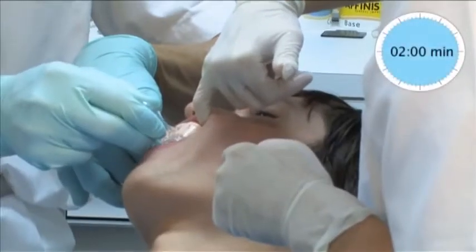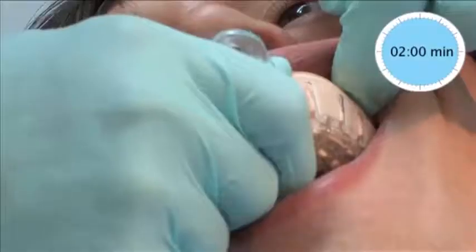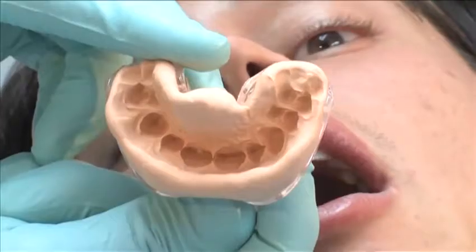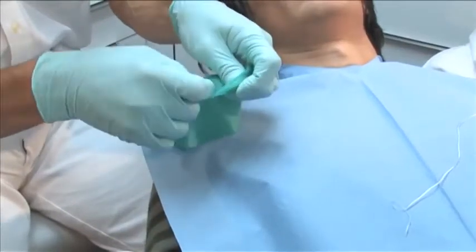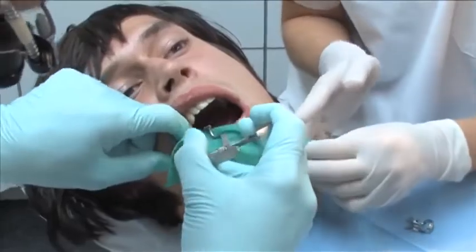The impression material is loaded into the single-use impression tray which was pre-coated with tray adhesive. The impression is then taken. A latex rubber dam is applied over the adjacent teeth to maintain a dry working field.